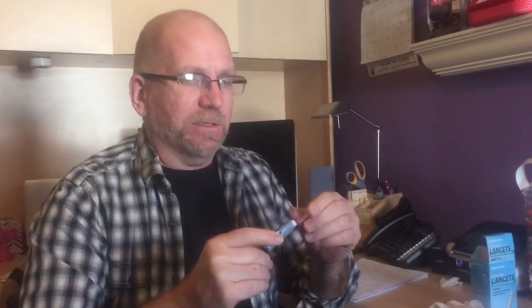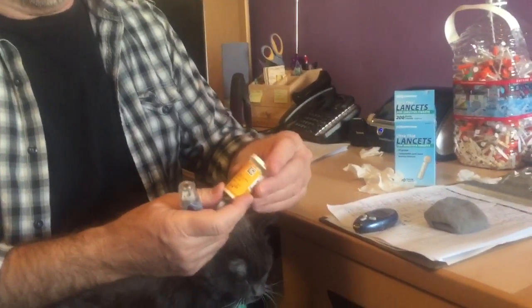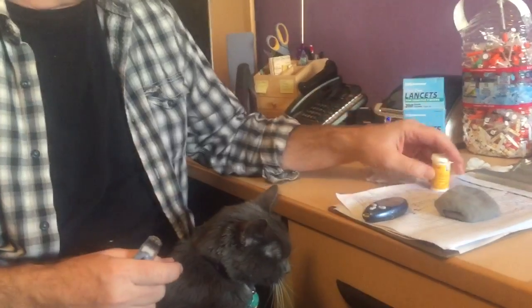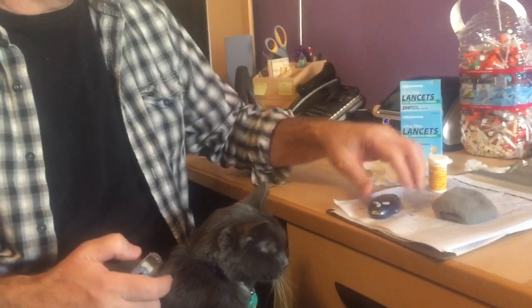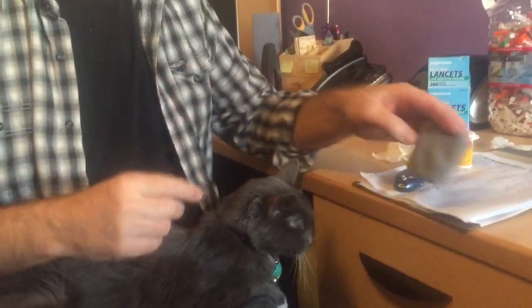Hi guys. So I'm going to show you how to use the tester, the test kitty. What you have is a lancet holder — the testy pokey thing — a box of lancets, a little jar of test strips, and the tester, as well as tissue paper and a little sock folded up that we use as a pad.